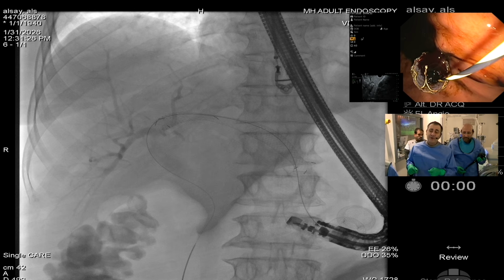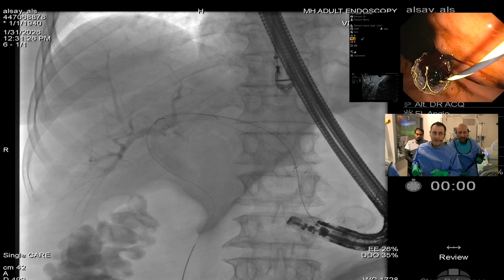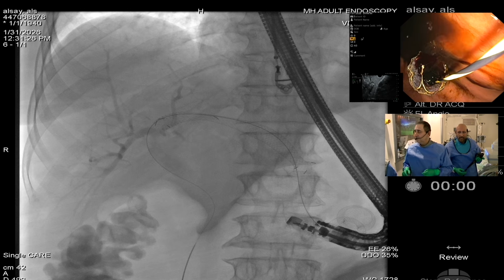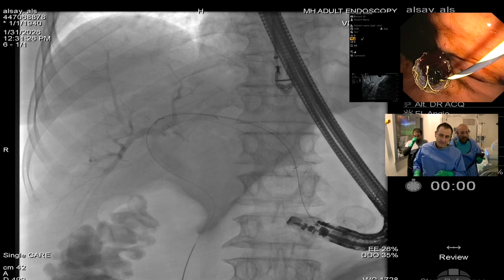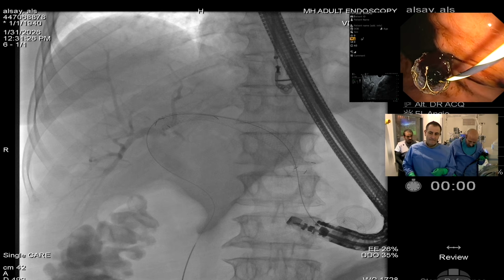The patient is supine. So that's the position you prepare. Oh yeah, absolutely. I do 99% of my ERCP supine. So the other thing is, why would you choose transpapillary or antegrade instead of double pigtail?